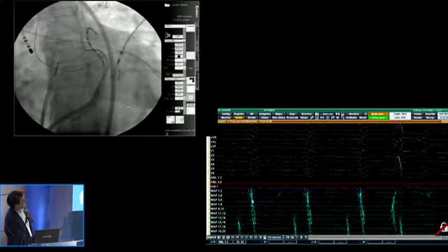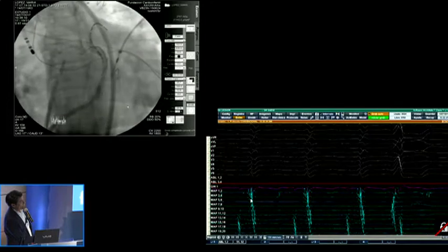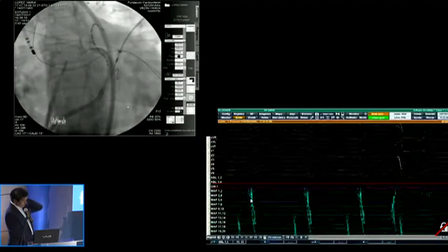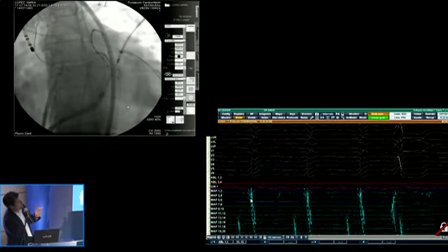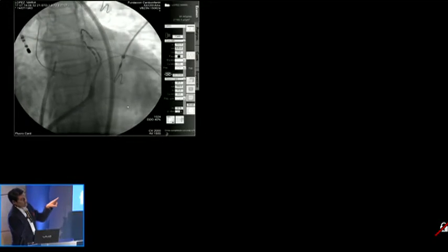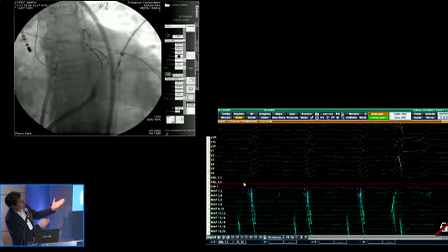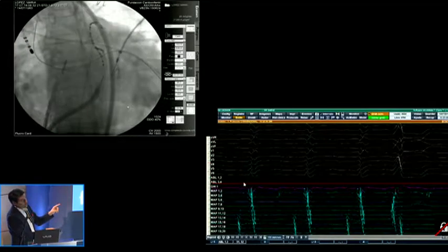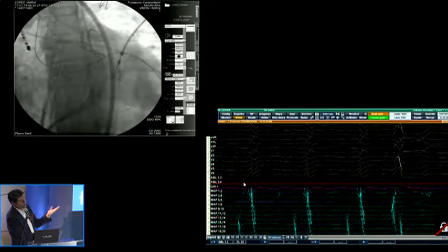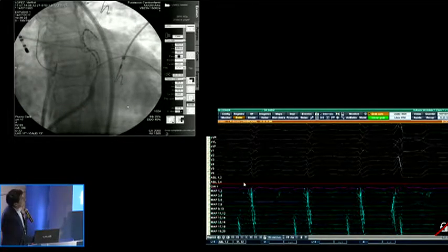What signals do we have here? Is the wire connected? No, it's too proximal. It has a lot of A. No, just a minute, Miguel. Do you understand that this is too proximal? Basically, it's the same concept used in the multi-electrode where you find A's and B's in the wire. It's the same idea. Where do you find A's and B's?